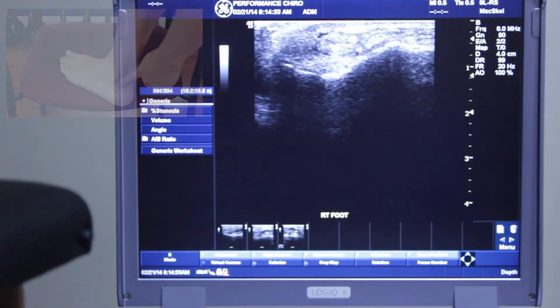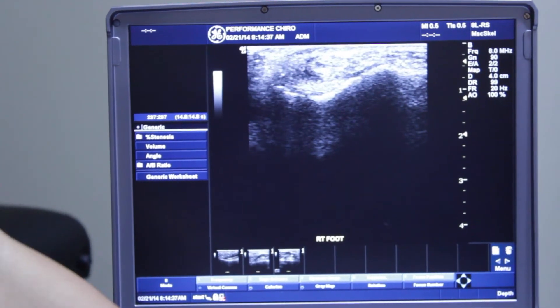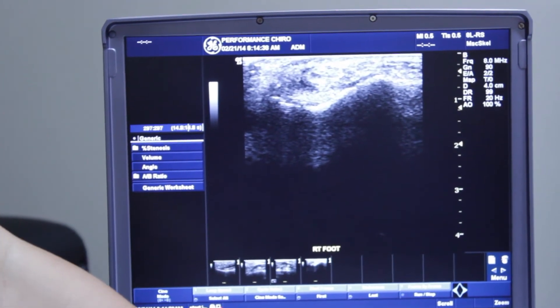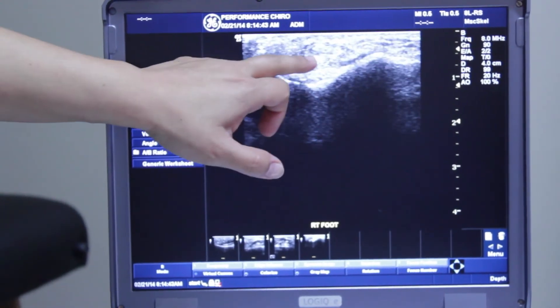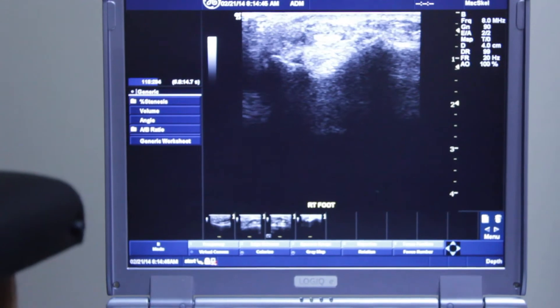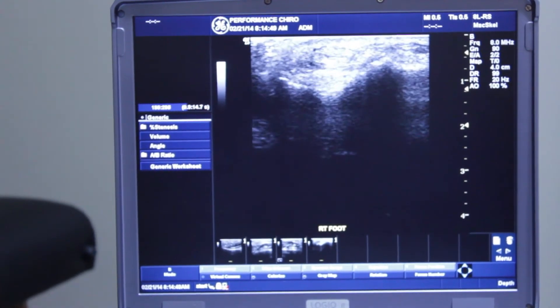Let me find a good spot — right here is decent. You don't have to move too far to see the difference. If I come back a little bit more proximally, that area looks almost normal.